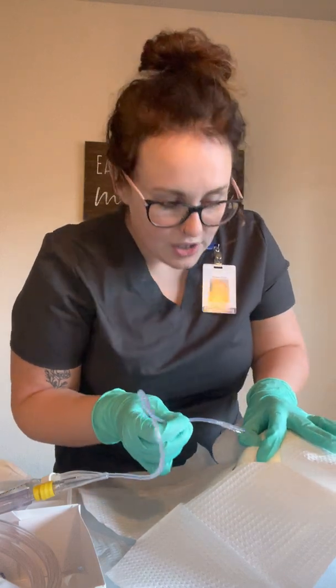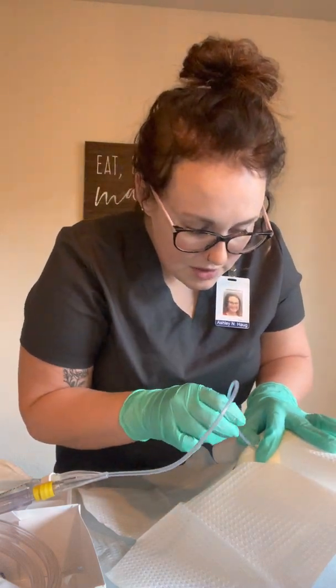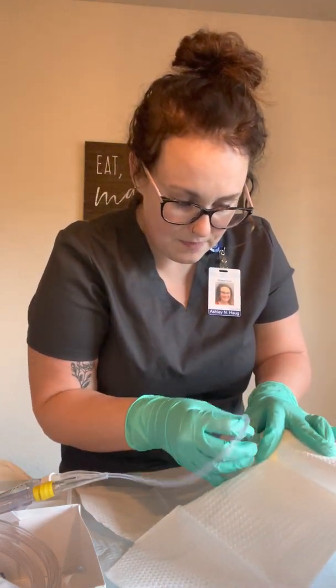Okay, and then I'm going to warn my patient, okay, we're about to insert, so I need you to take a big, deep breath in and then exhale. Good, and as she's exhaling, I'm going to insert this into the urethra. I'm going in until I see urine returning. So now I'm going to push it another additional about 5 centimeters or 2 inches.